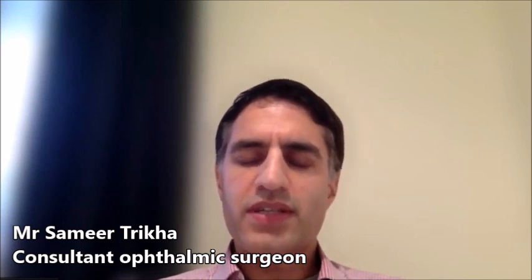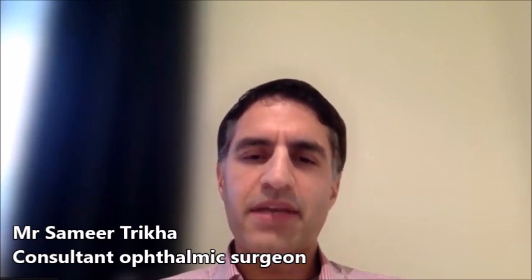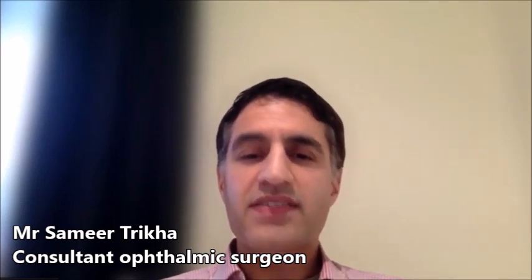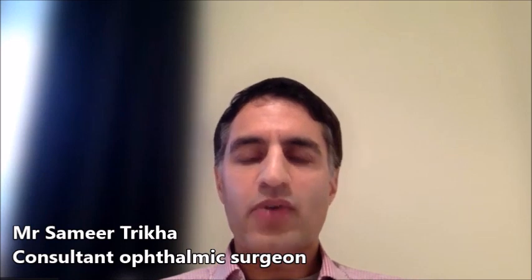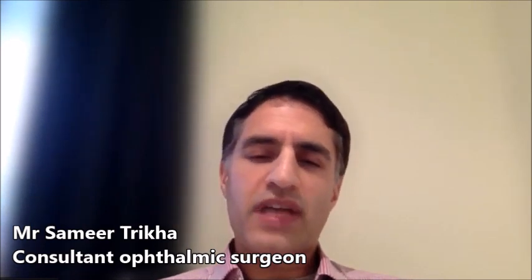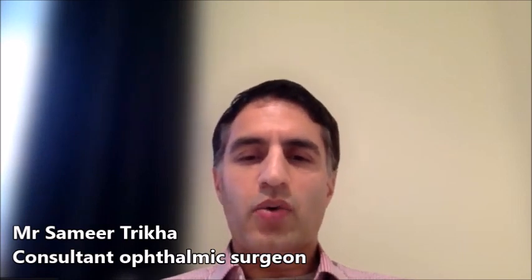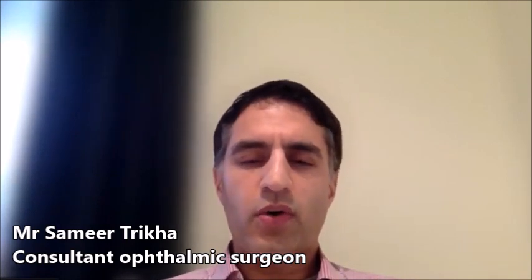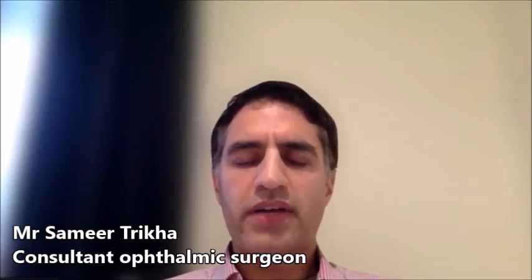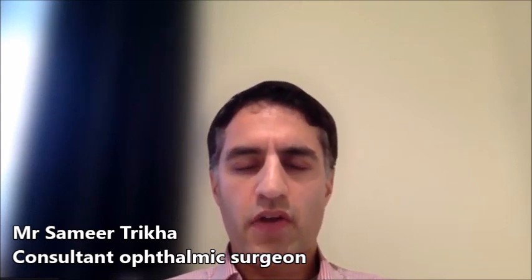In addition, I don't tend to recommend the multifocal lens in patients with macular degeneration, which is a condition that affects the central retina, meaning that they cannot read or see faces very well. Finally, if a patient has what we call a lazy eye or a weaker eye compared to the other one, or had patching as a child or squint surgery, I tend not to recommend multifocal lenses in those particular patients.